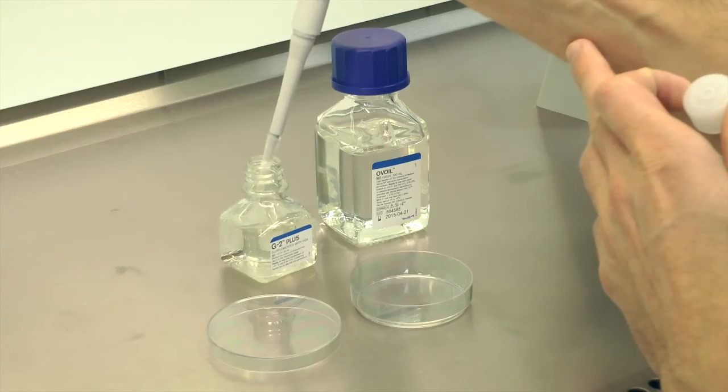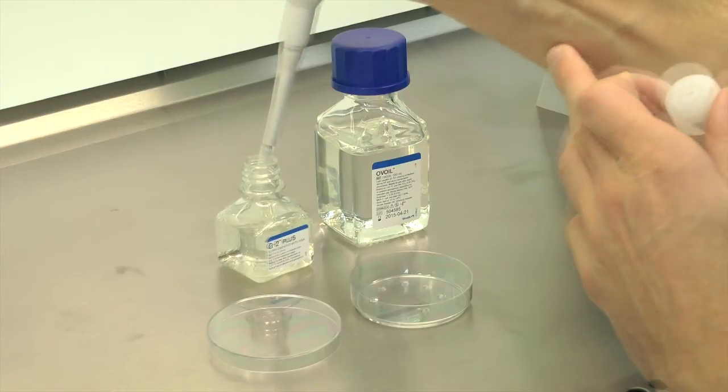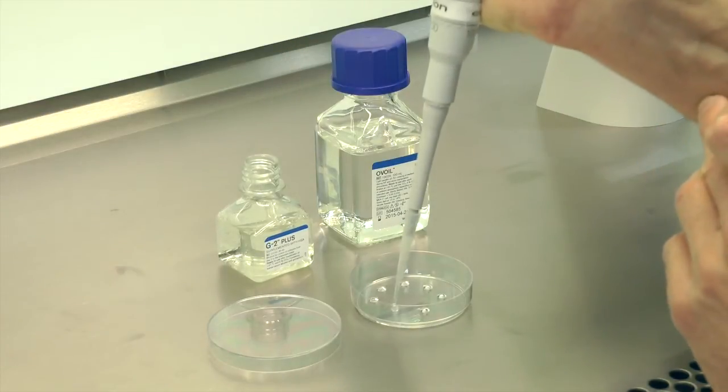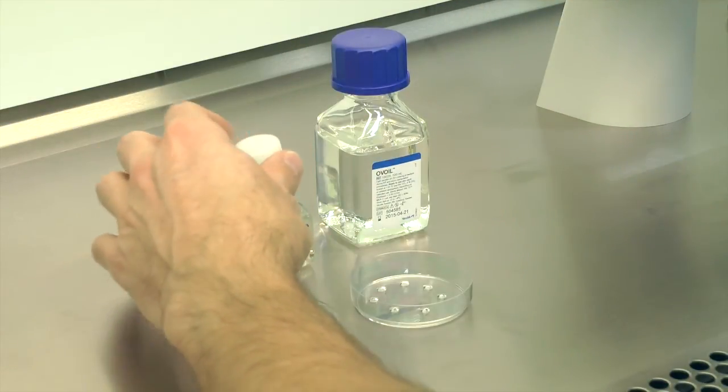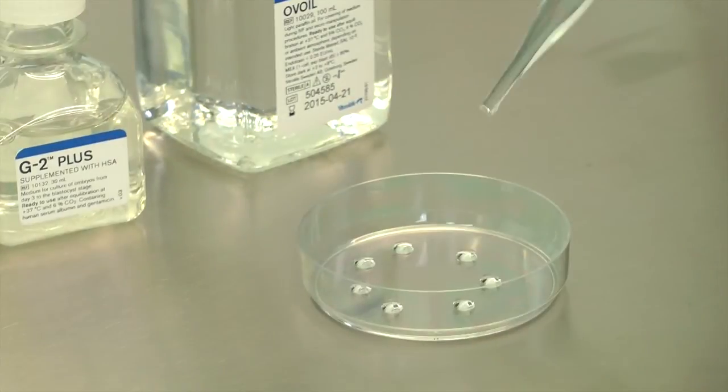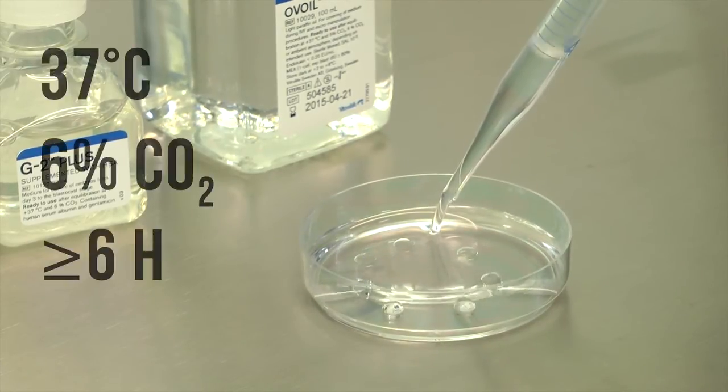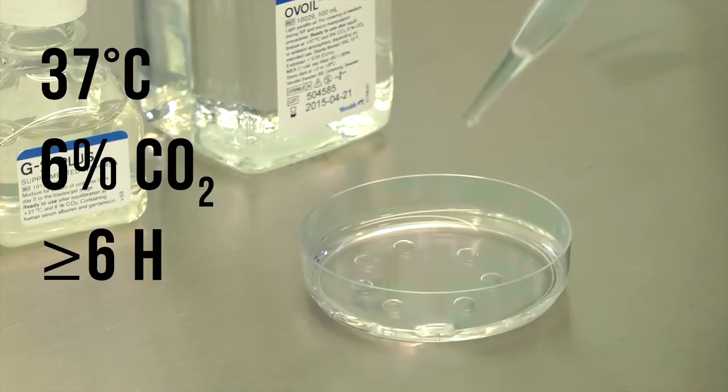If you do blastocyst culture, prepare culture dishes with micro droplets on the morning of day 3 using G2 Plus. Cover these droplets with oil and equilibrate it at 37 degrees Celsius and 6% CO2 for at least 6 hours.